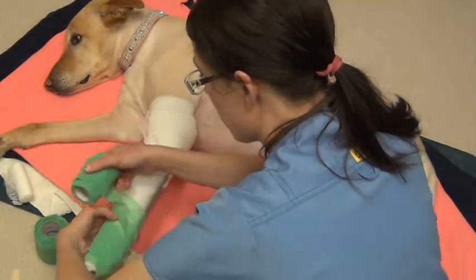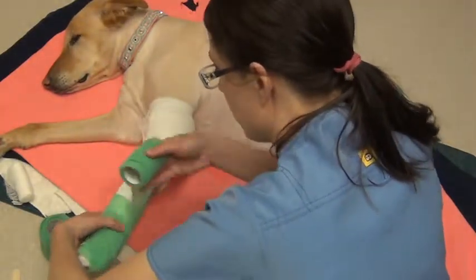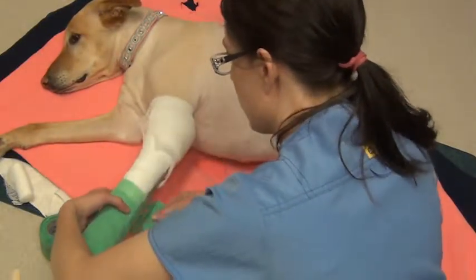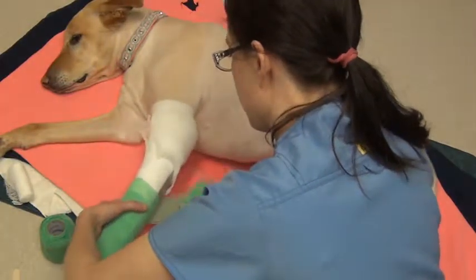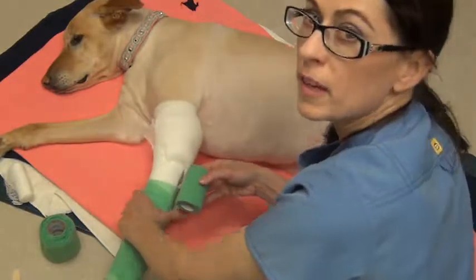Make sure that your splint's lined up, and just follow the 50% lay pattern, making sure that I cover the previous spiral 50%. We're going nice and light with our vet wrap. We're not putting a lot of tension on it.